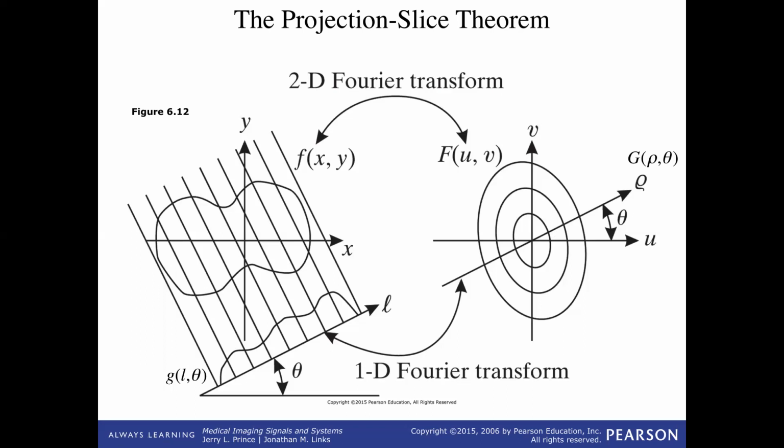And then you also go back and do a line integral in Fourier space, and then the inverse Fourier gives you the line integral from the original. True. Well, no, the line from the Fourier space would give you a line sample through the object. So the line integral happens on this side. You take the Fourier transform of the line integral, you get a single line sample through here. It's not an integral through the Fourier transform, it's actually a line sample. It's like a slice.